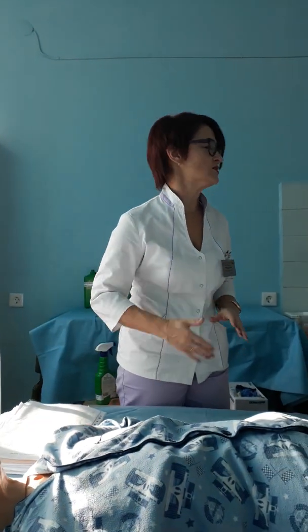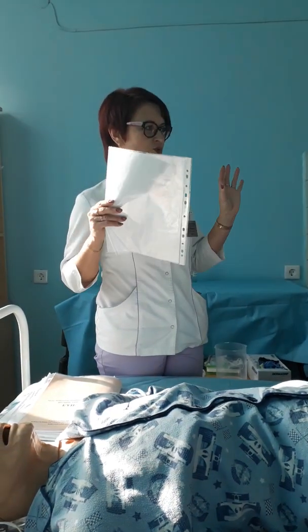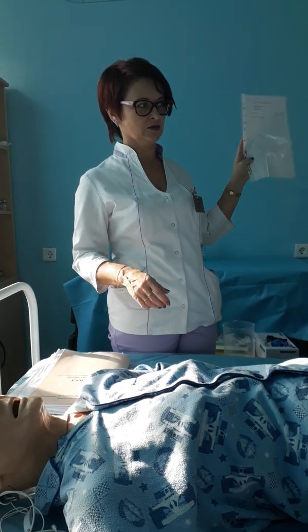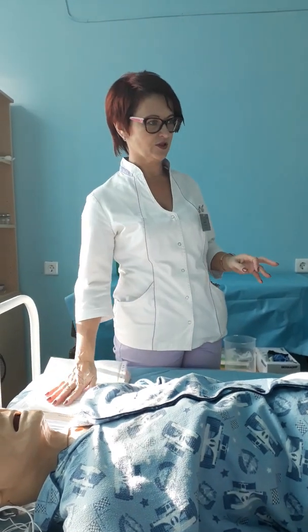Patient's report. Ma'am, new practical skills. It's new practical skills, yes. And again, you read information. First, you read information about your patient: full name, age, other information, and different contraindications. Next, you read information about your manipulation. This is the name of the medicine, doses, times, and way. Now you prepare for the intravenous infusion.